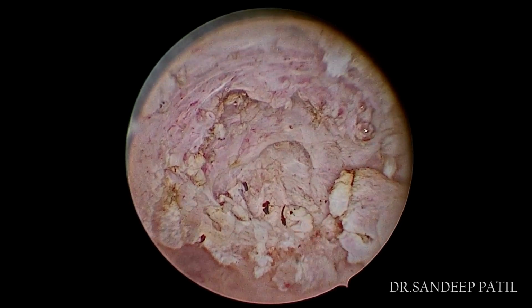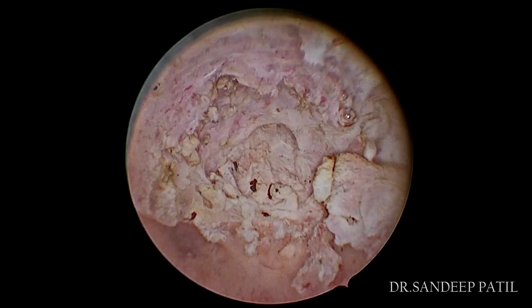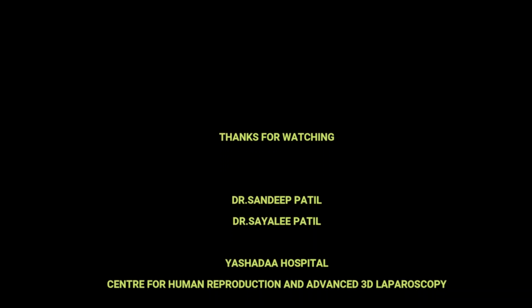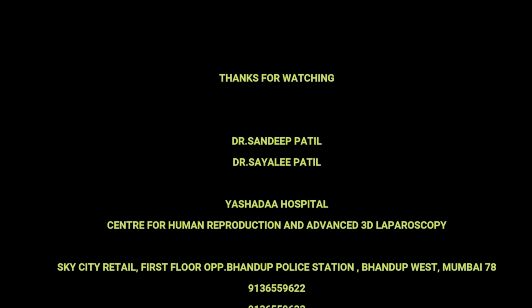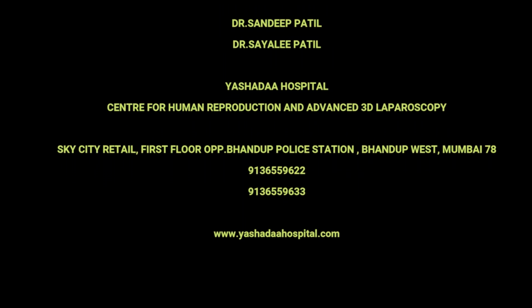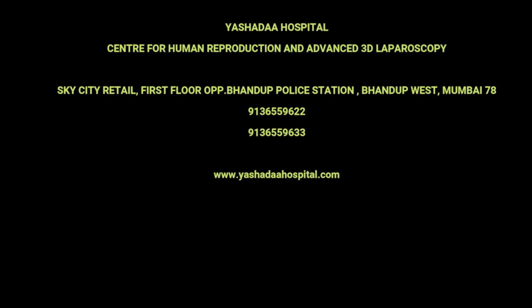To conclude, hysteroscopic resection of FIGO 3 fibroid requires surgical skill and good anatomical orientation. With appropriate case selection and technique, it offers a minimally invasive, fertility preserving option for symptomatic women.